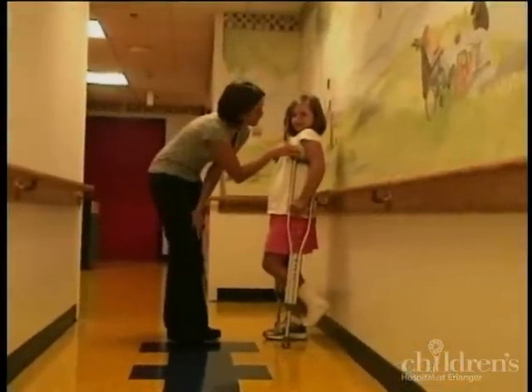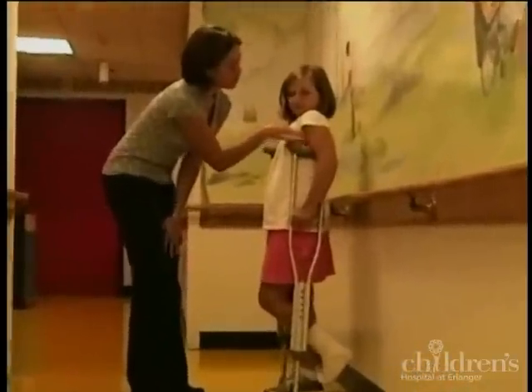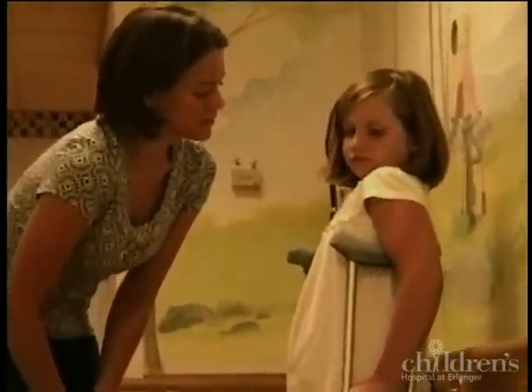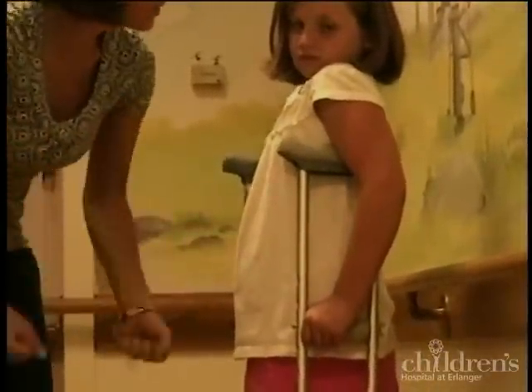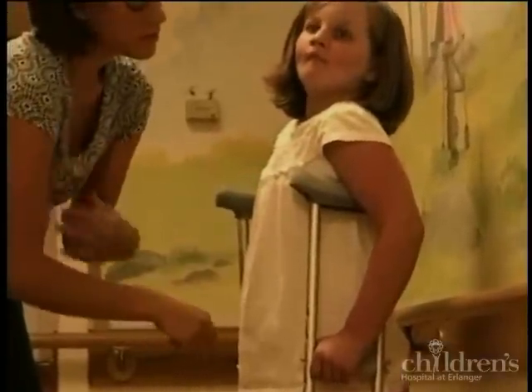Here's another look at how we need to fit the crutches. You need two to three fingers between the top pad and her armpit so that you're not compressing the nerves in her axillary region. We also want her to have a 15 to 30 degree bend in the elbow so that she can get a good push through her arms and we're not hanging on the crutches and compressing nerves.